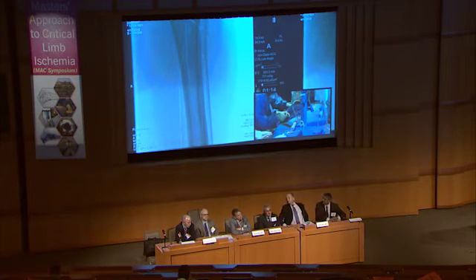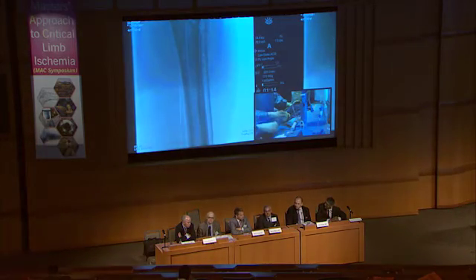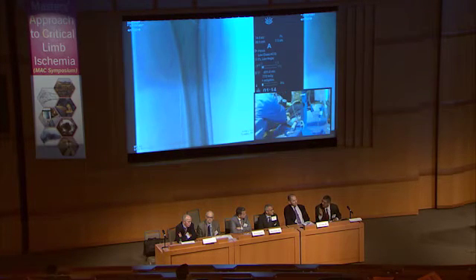I'm not thinking coils, I'm thinking more Onyx glue, because you've got so many small little branches. Just go down in your tertiary branches and see where the greatest contribution is and just put some Onyx. I don't want to say this, but we just published a recent paper of coronary perforation plugged with subcutaneous fat. We took subcutaneous fat from the patient's groin, put it through an introducer and injected it into the distal branch of a diagonal. It was presented at TCT this year, ACC this year, and also published. So something to think of, but I've never done this in the profunda.